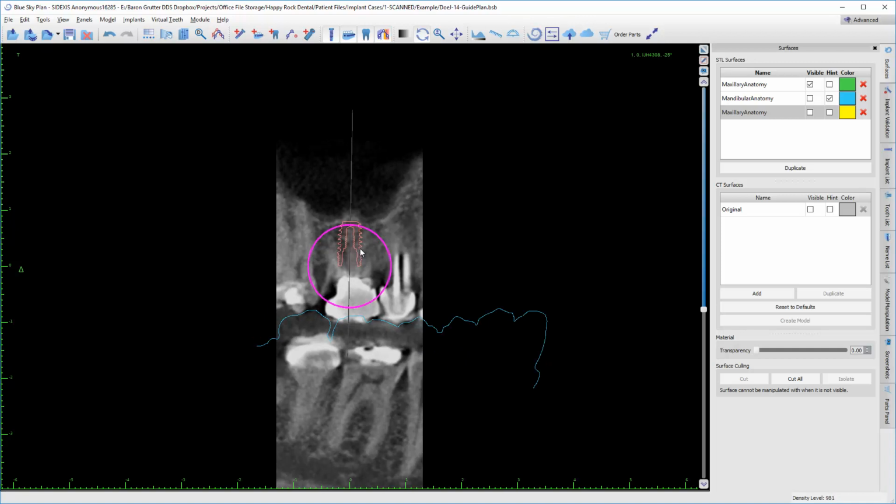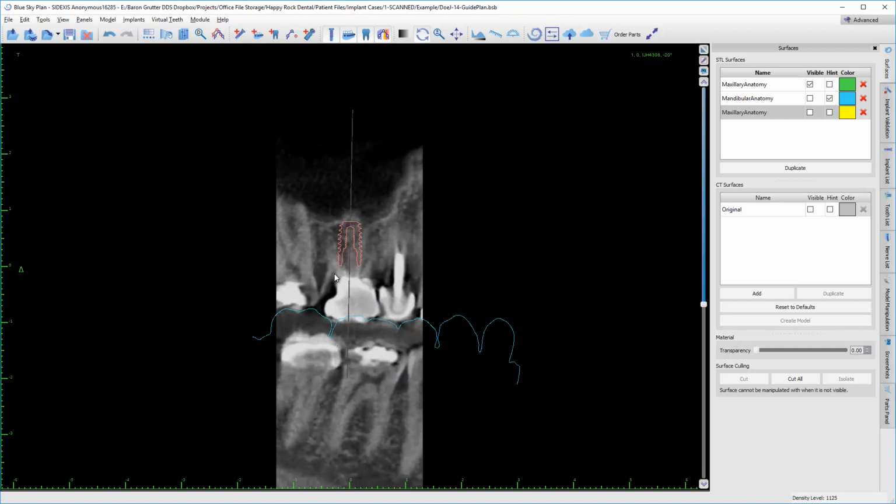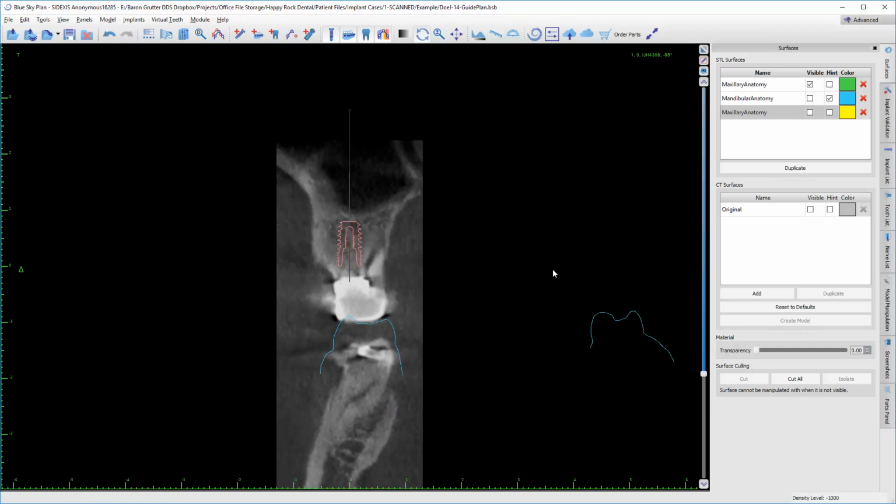Now, one thing I am noticing is there's this distal bony defect, whatever reason he's had this bone loss. And that's got me almost, if we draw a line from this bone or this area to this area, I'm practically equal crestal. And if you've watched any of my cases or videos, that's not something I'm really excited about.